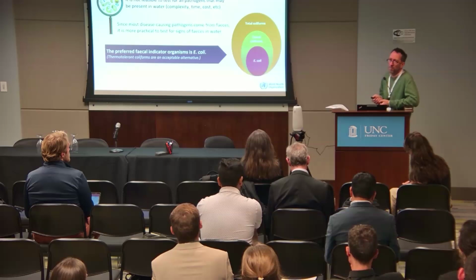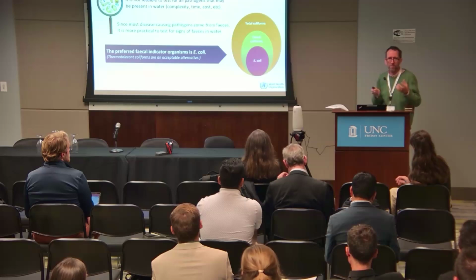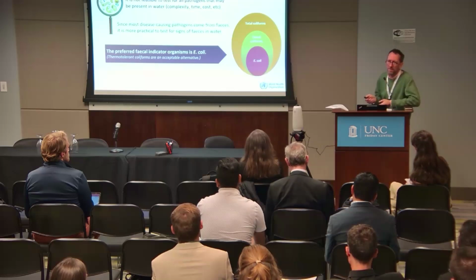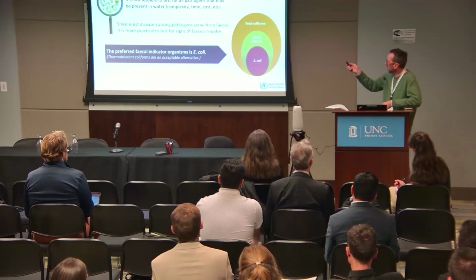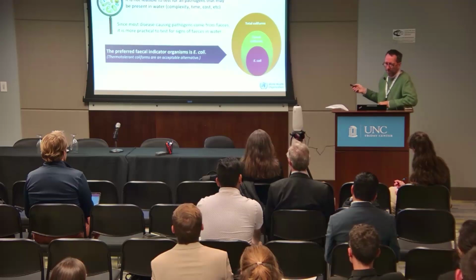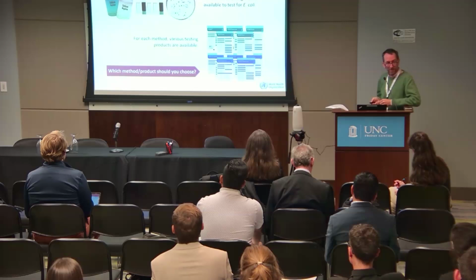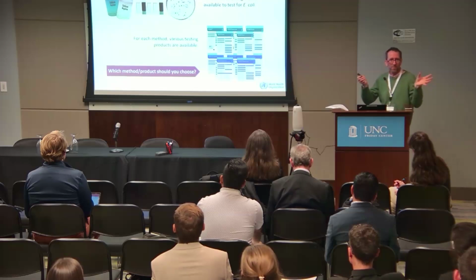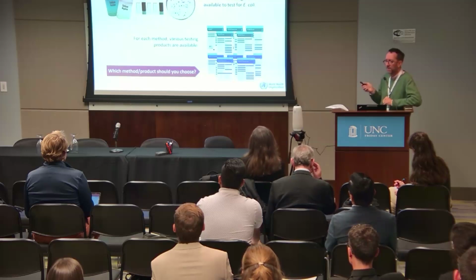We would think of total coliforms as a good indicator of process integrity if you have some treatment system in place, but not necessarily an indicator of fecal contamination. So we look more towards fecal coliforms, or ideally E. coli, for fecal risk. Combined with the sanitary inspection to see what risks might not be translating to microbial contamination at the time of the test.